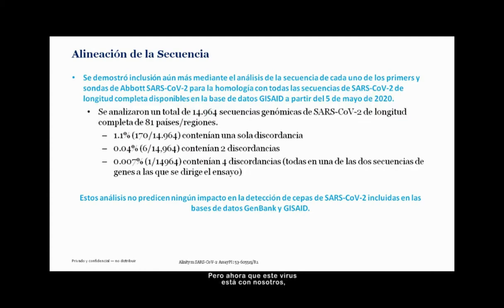But now that this virus is with us, it is part of our global surveillance program, so we are actively looking around the world in many different countries, generating sequence and looking at the homology to our primers and probes and the performance of our tests. So this is firmly part of our global surveillance program and our reality moving forward.